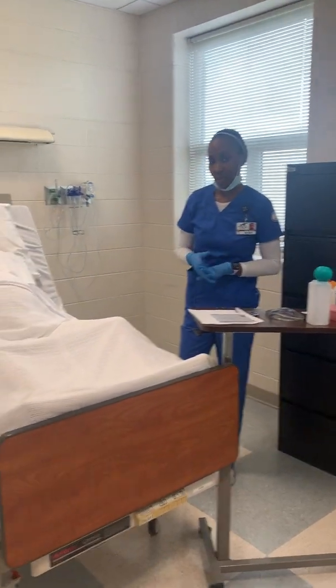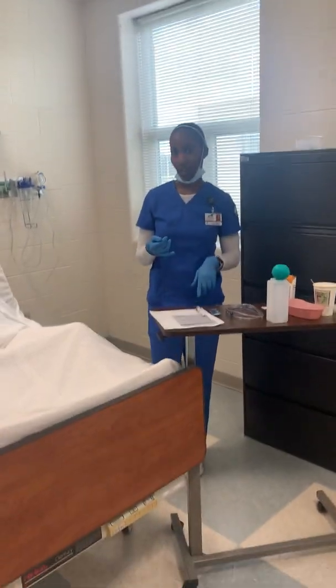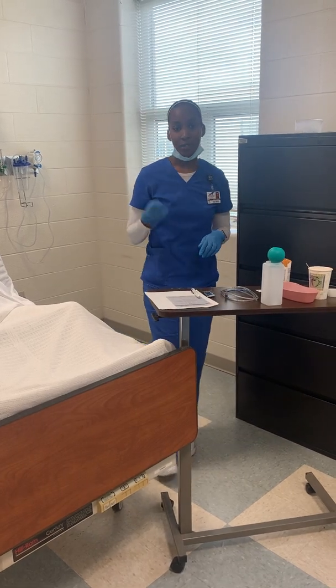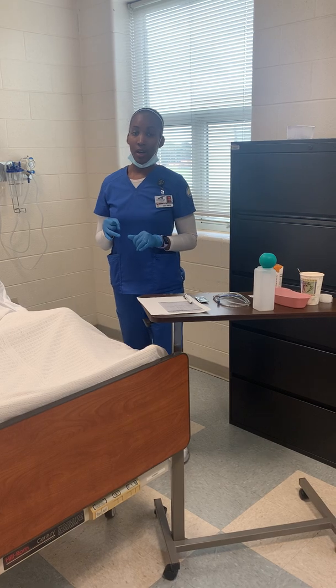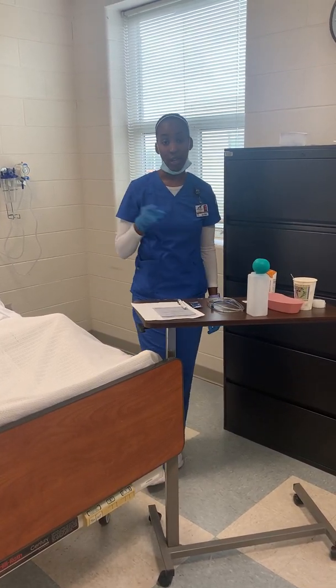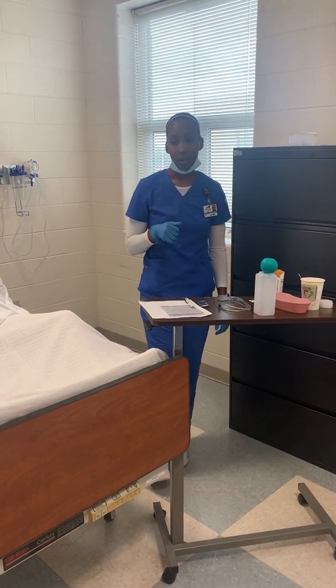I'm Chastity, and I'm here to perform the NG insertion, lavage, and gavage. First, my safety practices. I want to verify my doctor's order, hand hygiene. I will verify the facility procedures. I'll look at manufacturer's notes for any equipment to be used.